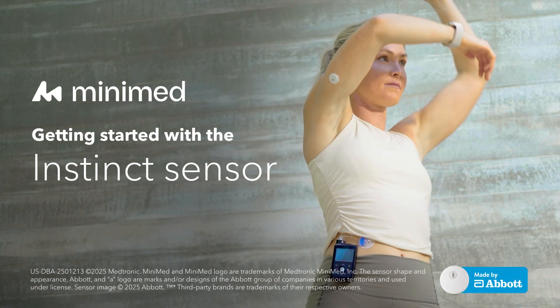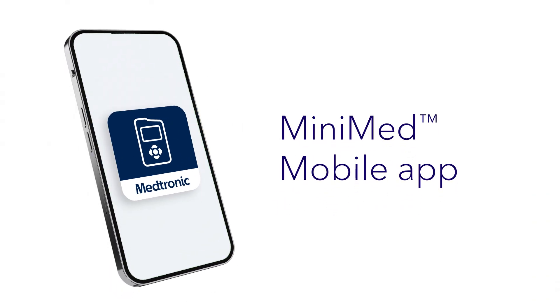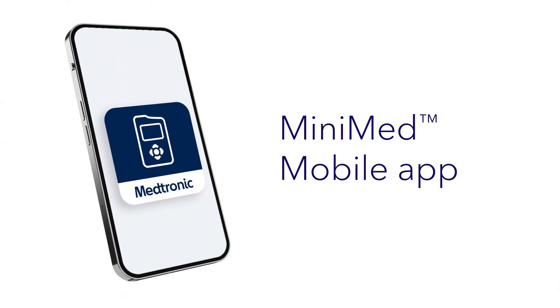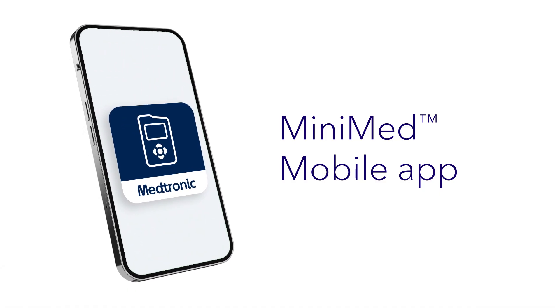Welcome. In this video, we'll show you how to insert and start your new Instinct Sensor. The MiniMed mobile app provides step-by-step instructions on your phone to guide you through the process. This video is here to show you what it looks like, so you'll know what to expect.